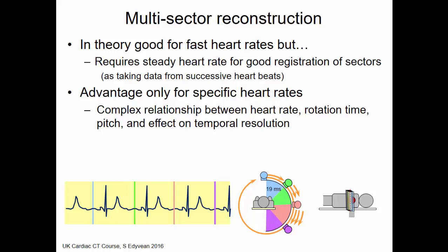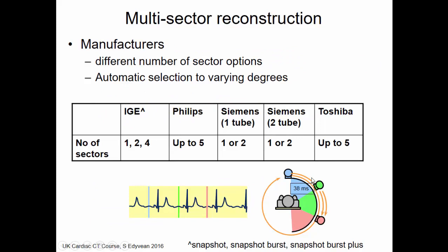Now, fortunately, all the manufacturers, except GE, calculate it for you when you opt for the multi-sector reconstruction. GE give you guidance as to which approach to use.